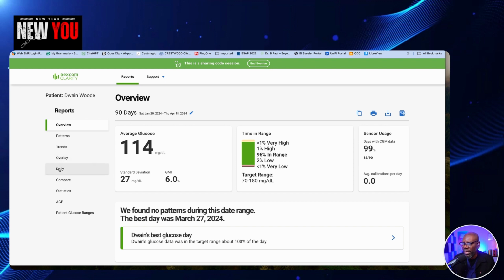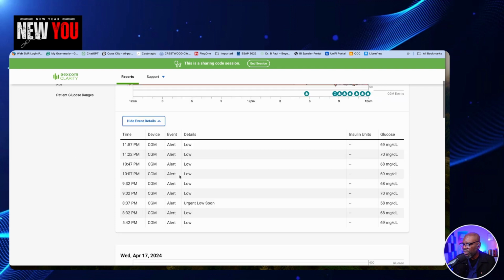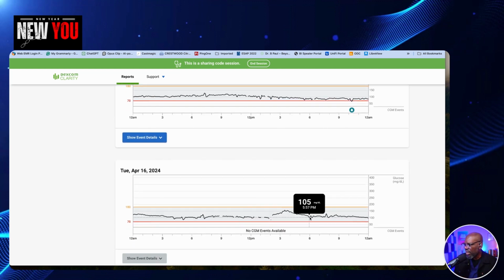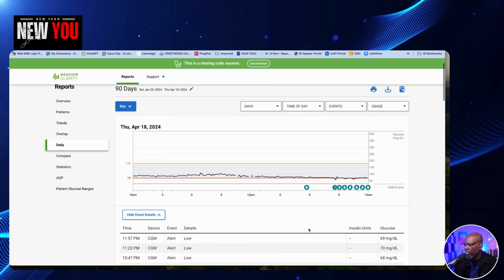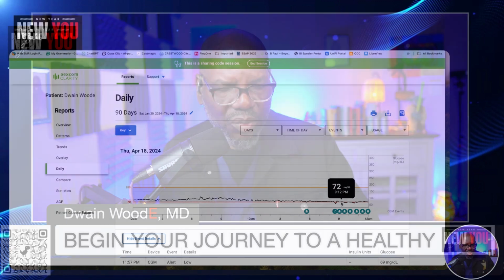And if I scroll down and look at my daily graphs, have that pull up there in just a minute. So this is going to give us, let's see, where were we? So I started fasting on Tuesday. So Tuesday, right at 6 o'clock, my blood sugar was 105. 24 hours later, blood sugar is 84. And then today, 24 hours later, blood sugar of 77, right? And in fact, as we come into the rest of the evening, we'll see that it's starting to drop down into the 60s. And I would expect tomorrow, when we look at this again, that my blood sugars at that point would be in the 60s, kind of hovering in that area.